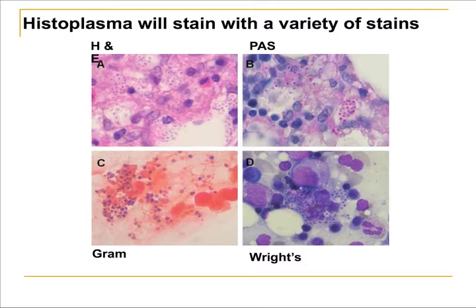On the next slide, we talk about a rapid diagnostic test used for histoplasmosis, and that is detecting the antigen of histo in urine. It is a quantitative enzyme immunoassay. It can be done on a random urine specimen, and it's very useful for detecting disseminated infection and chronic pulmonary disease. The antigen of histoplasma is detectable in about 85% of these infections. It's good for diagnosis of immune-suppressed patients that do not produce a detectable antibody response.